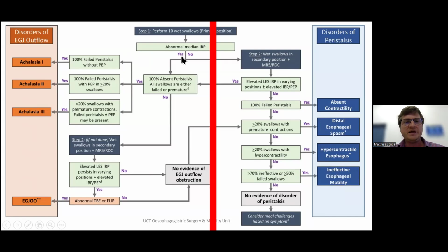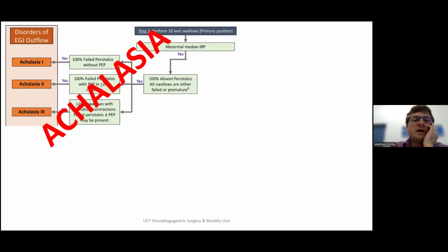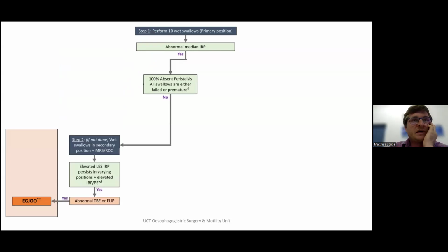If we move to the left here, we either are dealing with an achalasia, and so we look at the IRP plus failed peristalsis, and in achalasia, there must always be 100% failed peristalsis. Based on what that peristalsis looks like, we then divide it into type 1, 2, and 3. I'm not going to spend a lot of time on achalasia today per se. Or if it's not achalasia, in other words, the IRP is raised, but there is peristalsis, we are dealing with an EGJ or OG junction outflow obstruction.